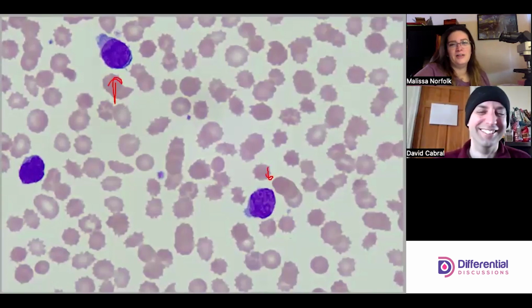I love it. But yeah, definitely a really prominent nucleoli.